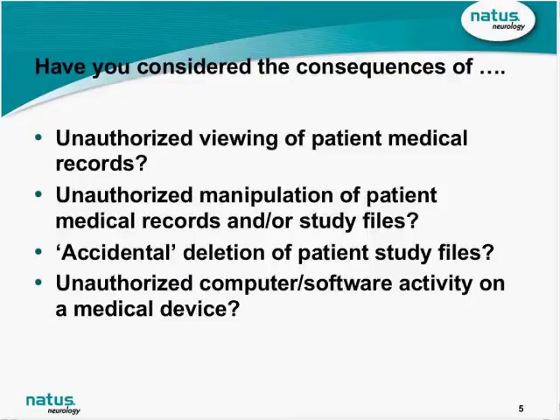Alright, so I want to start off by asking you, have you considered what would happen if someone who is not part of your staff is walking by and happens to get a view of the screen that you're working on that displays a patient medical record? How do you deal with that?